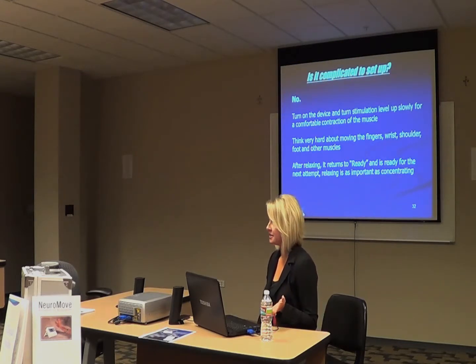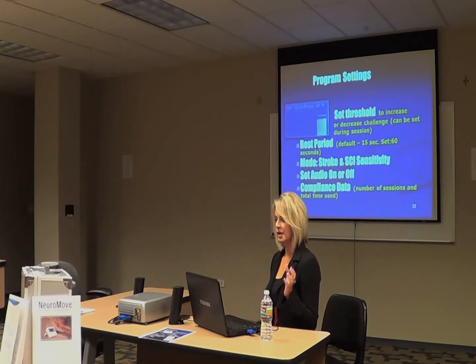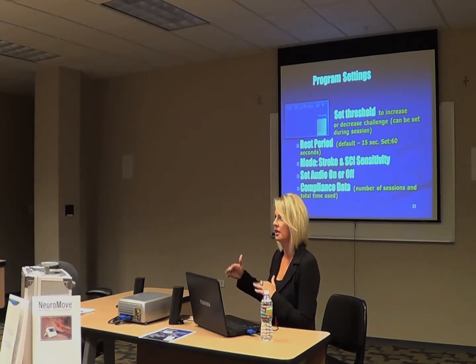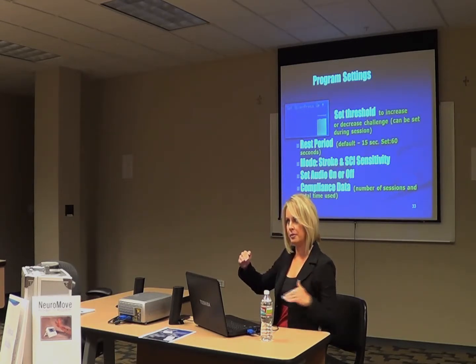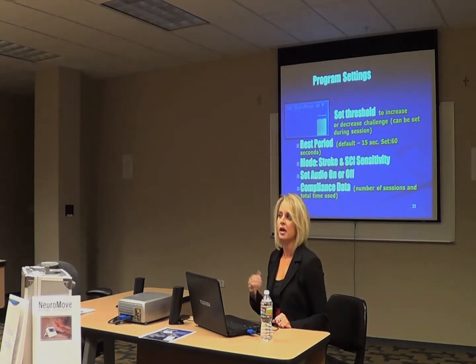It's not complicated to set up. I'm going to show you how that happens. The settings are to basically, you as the therapist can change the threshold. If you've got a patient that's struggling a little bit, they're not meeting that threshold, and the device won't go lower than the background muscle noise is. So you might want to just incrementally take that down just a hair, and I'll show you how that works.